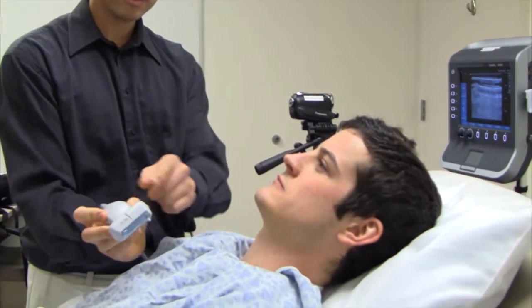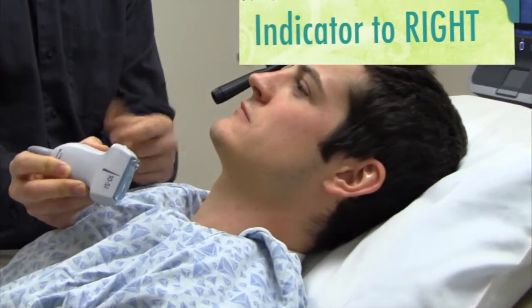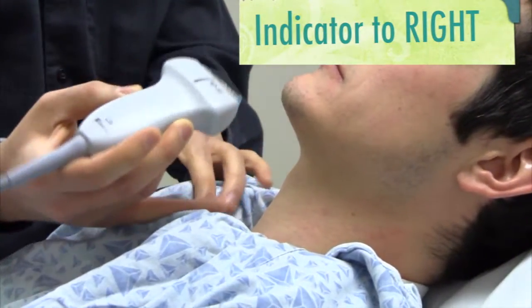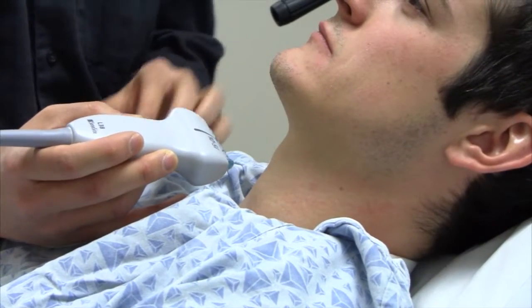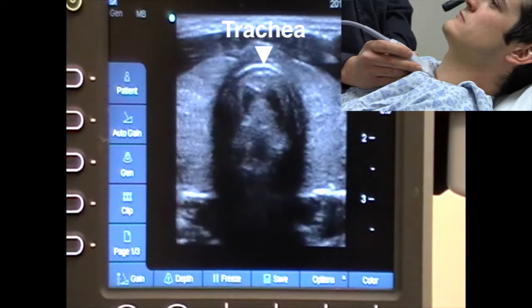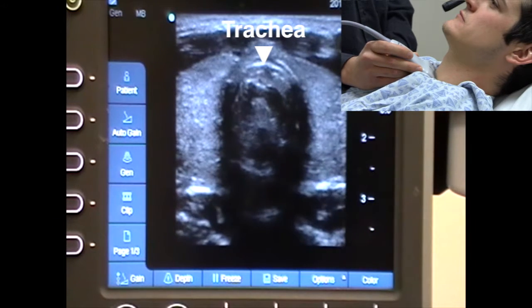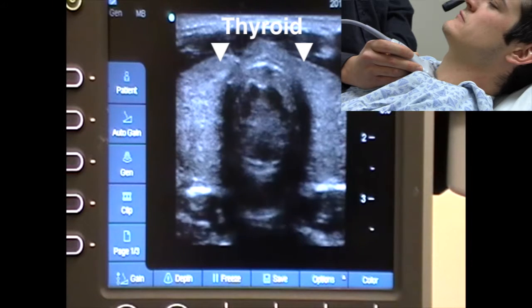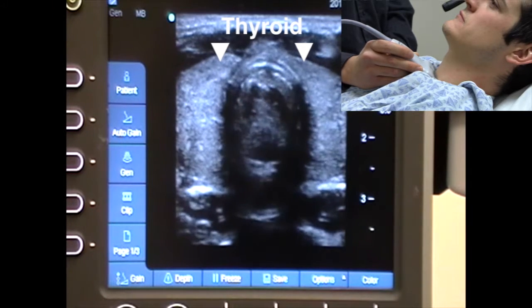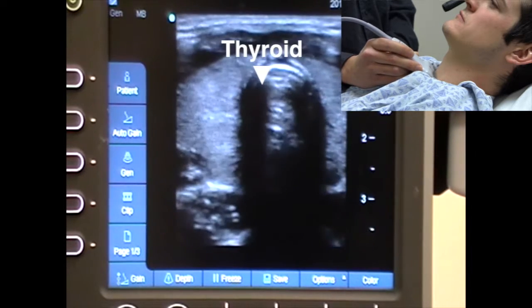Here's our model. We're going to focus on his neck. This indicator right here is going to be towards the patient's right side — indicator towards the right. I'm going to go right in the middle of his neck where the thyroid would be and place the probe there. When you look on the ultrasound screen, you see right in the middle the trachea, and flanking the trachea is the thyroid. The thyroid has a grayish appearance.